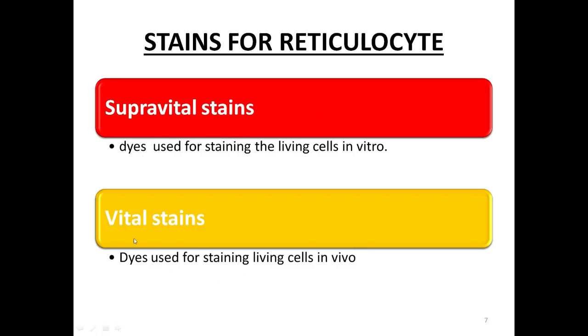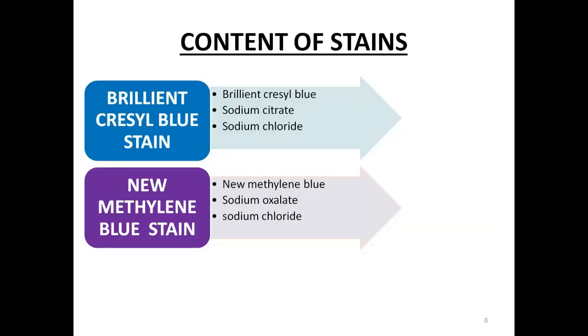But in vital stains, dyes are used for staining living cells in vivo, meaning we inject a dye inside our body, and then we take a sample. Okay. So that is the difference.